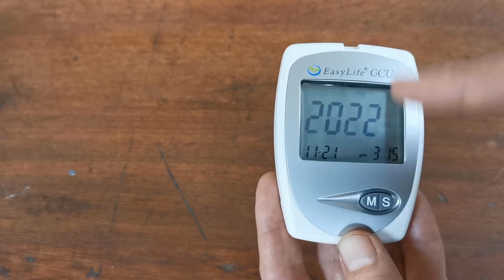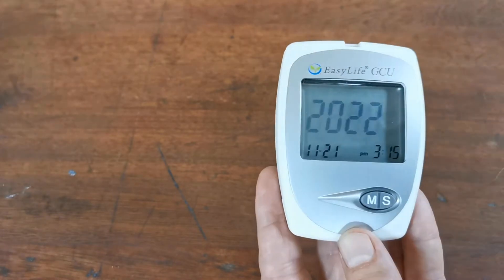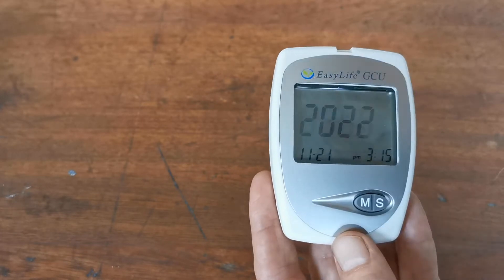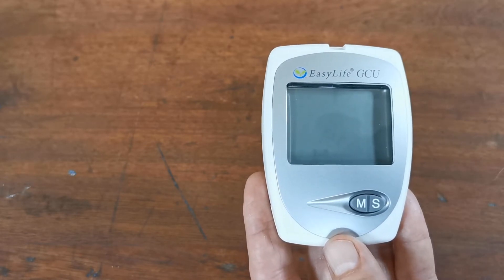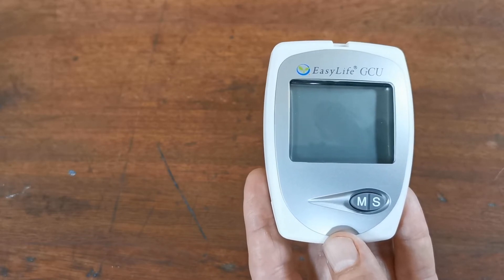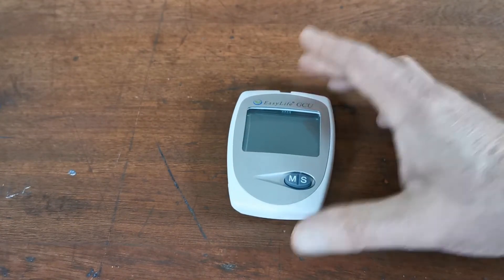Now you'll see it's reverted back to the first setting and you can work your way around it. If you were too slow putting the batteries in and it's completely switched off, just open the battery compartment again and remove one of the batteries. After about 10 seconds, if no activity is detected the meter display will turn off to save power, and then you're absolutely set and ready to do your first test.